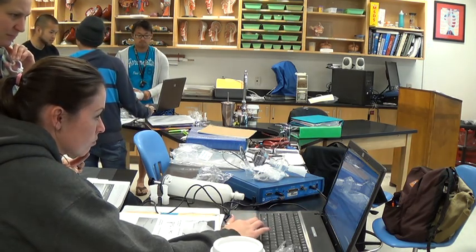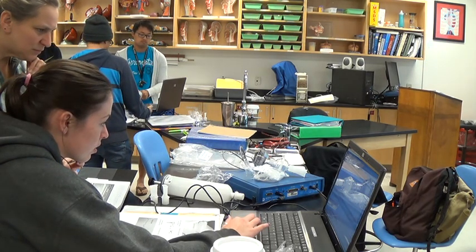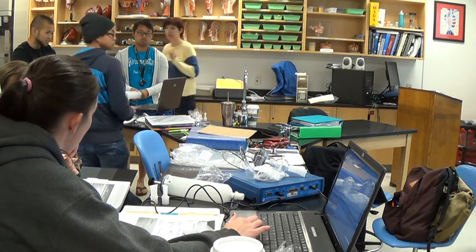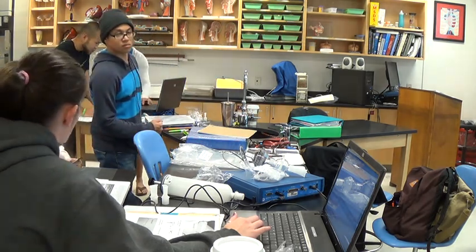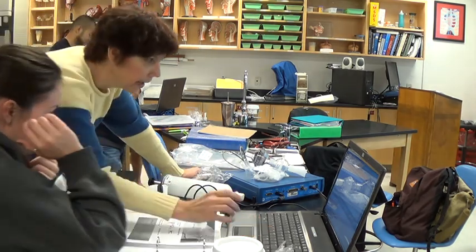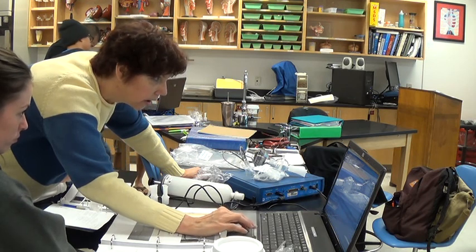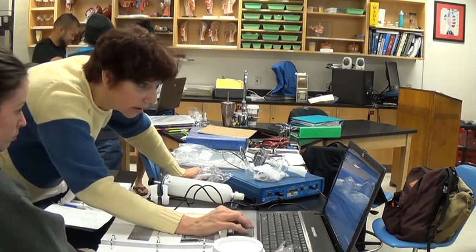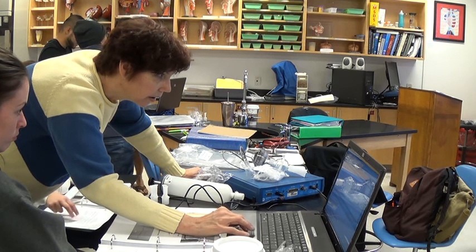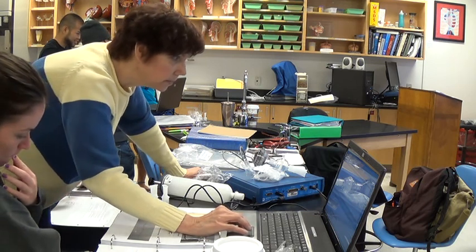Let me just try to do it perfect. Okay. So 3.4, you want to say 3.5? It says vital capacity. Well, you have to do it to the nearest tenth, so it'd be 3.49, yeah. Oh, so she was telling us how we can get the expiratory reserve. So it'd be 3.490 liters, I mean 3490. I thought it said you only had to do two decimal spots.